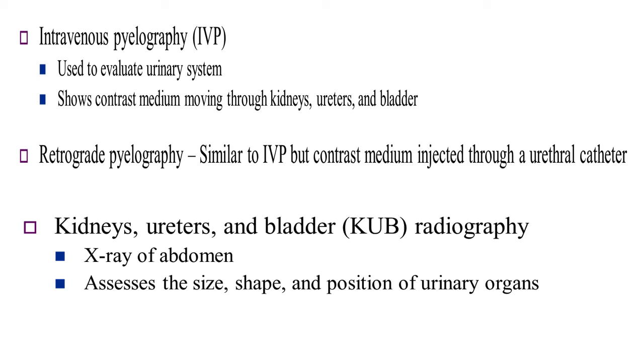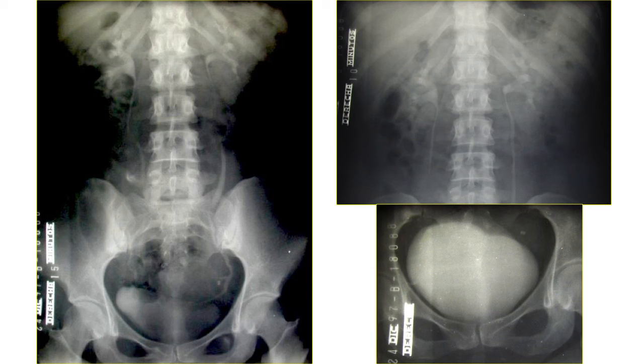Also on the fluoroscopy, we can do intravenous pyelography, okay, to look at the kidneys, which is a very important study, and we do a lot here in Ghana of this kind of studies. This is an example of intravenous pyelography, so you can see white, or opaque. Remember, let's forget about the white, let's talk about opaque, okay? So we talk about opaque areas, so you can see the kidneys, the ureters, and the urinary bladder, the opaque area.